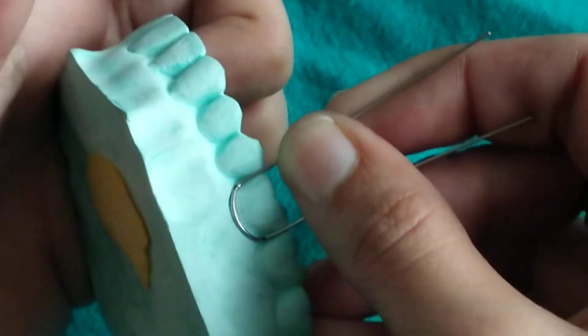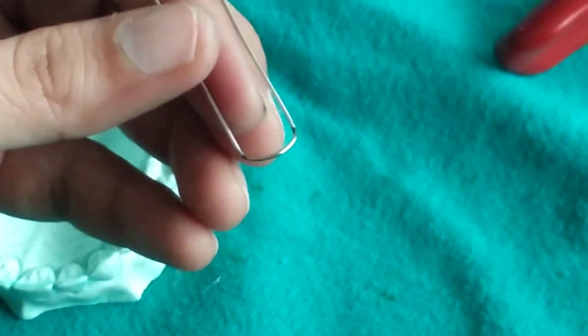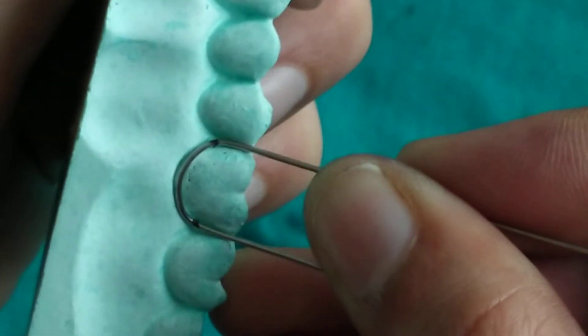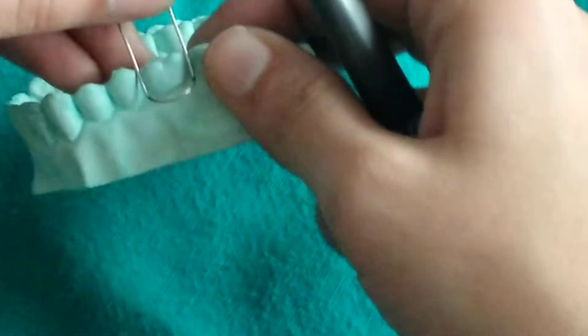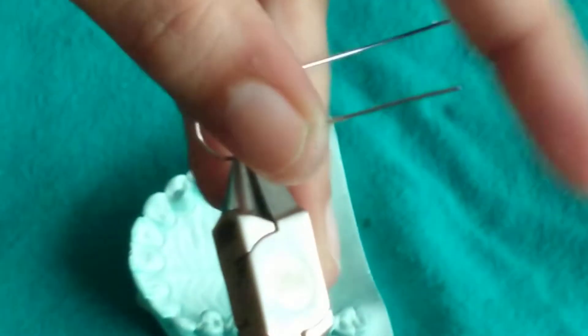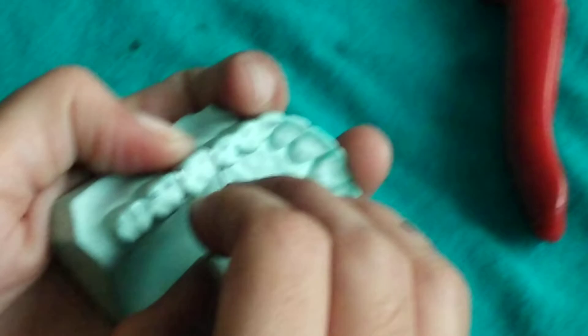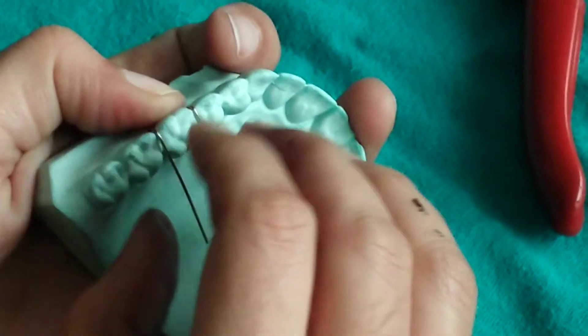Now we will be adapting the interproximal wires so that it passes through the occlusal embrasure, marking the location of the occlusal embrasure. We will give an acute bend at the point of the occlusal embrasure. Now we have given occlusal bends at the occlusal embrasure.